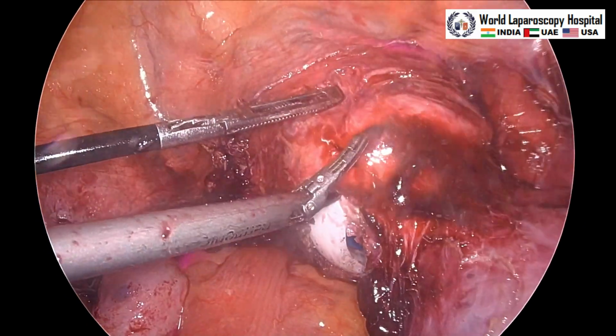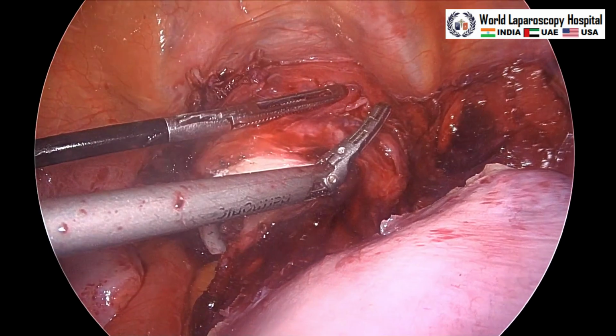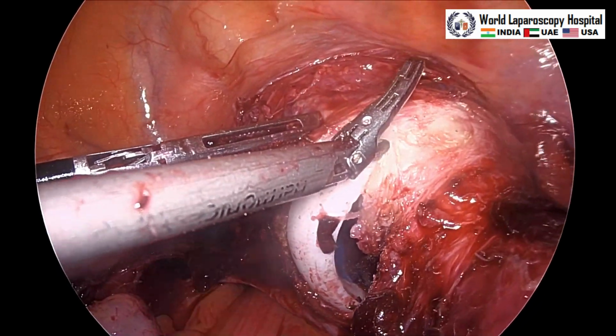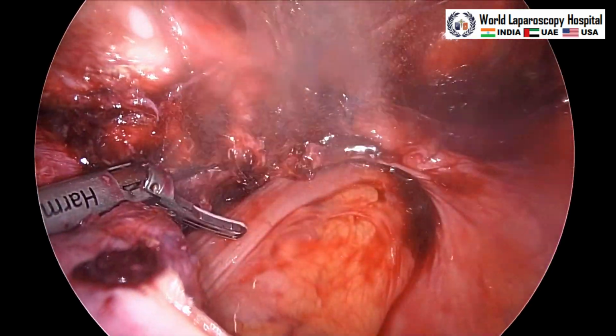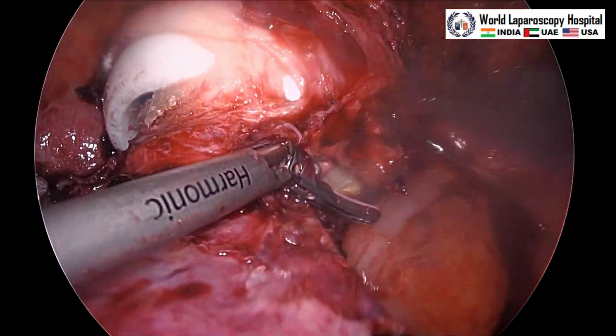So this is now anterior. This is the anterior colpotomy, and similarly we will go to the right side. So this is slowly over the white part of the colpotomizer. This is anterior colpotomy. And now this is the right lateral colpotomy.